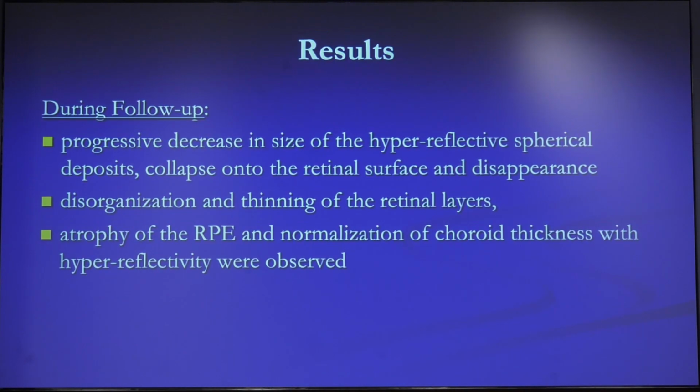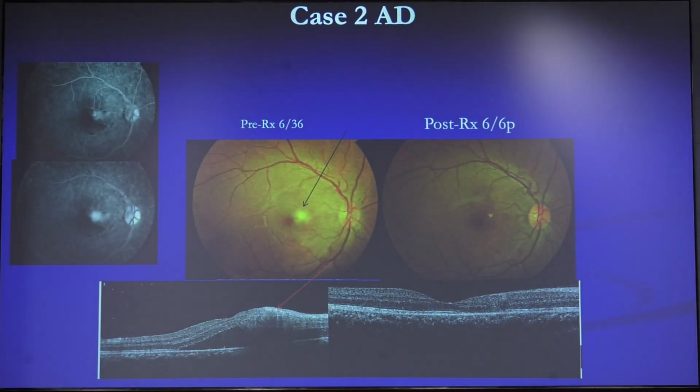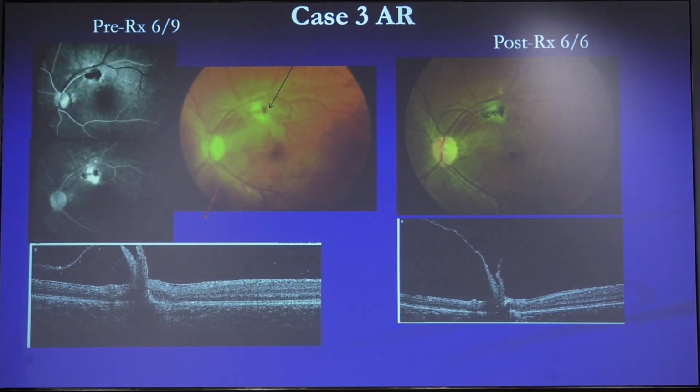So toxoplasma has already been shown, OCT has been shown. I'll just end with these final few cases. These are some cases which we saw, and you can see here that on FFA there is a speckled hyperfluorescence corresponding to the juxtafoveal lesion, and on OCT you can see the flattening out with treatment. Again, retinochoroiditis primarily involving the inner retina, later on resolving on OCT, and the angiogram shows hyperfluorescence which becomes intense later and gradually settles with treatment.